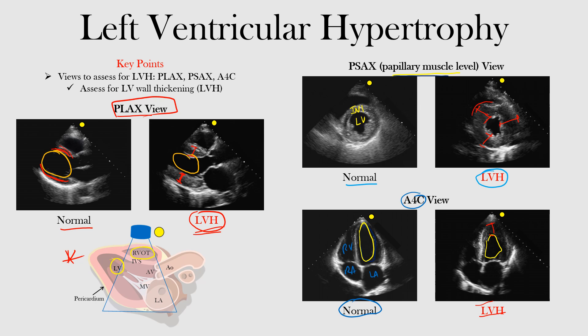We've gone through three different views. In the parasternal long axis view, notice the thickening of the left ventricular wall — here is the left atrium, the aortic valve, and the outflow tract — we're focusing on that LV cavity and the thickening of those walls. We saw the same thing in the parasternal short axis view and the apical four-chamber view. The wall is thickened, the cavity is getting smaller. The goal was to show you views to identify left ventricular hypertrophy at bedside, which can help our differential diagnosis — for example, a patient with bad hypertensive disease causing significant LVH.